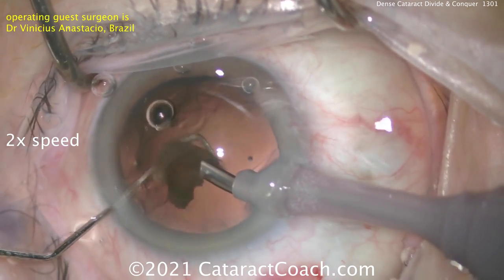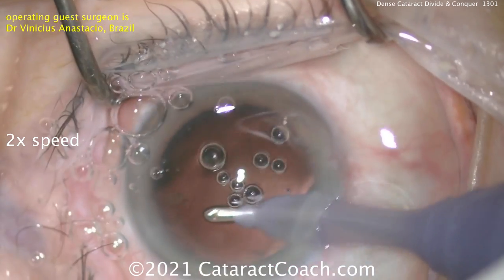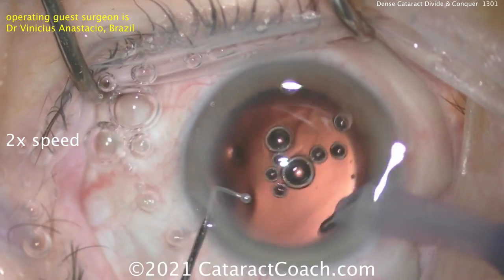This is a pleasure to watch. I love to watch other surgeons operate — I learn so much. Notice he didn't do a small rhexis; a nice, generous rhexis — and that's important. Not much cortex to clean up, maybe just tiny little wispy strands here and there, which will be easy enough to remove.